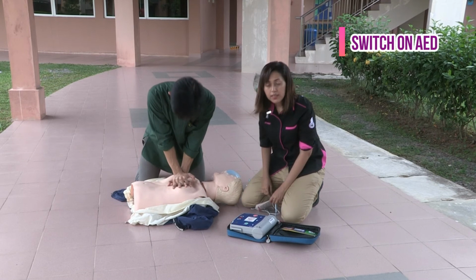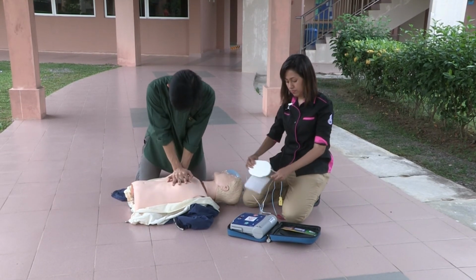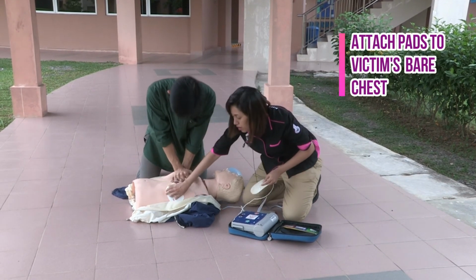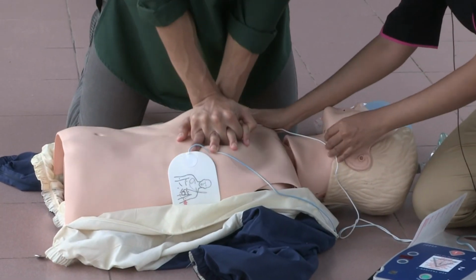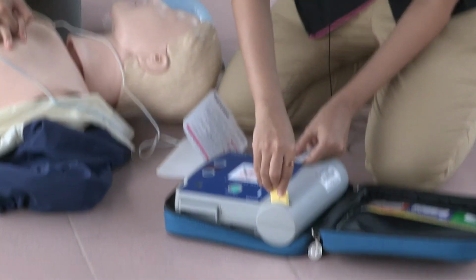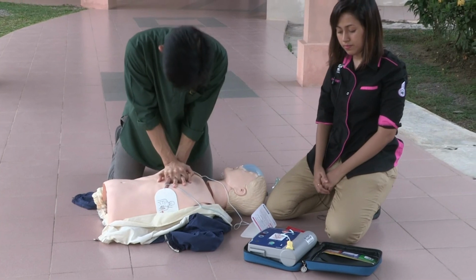Press the on button. Apply pads to the patient's bare chest. Step number 2. Plug in pads connector. Apply pads next to the flashing light. Step number 3. Plug in the connector.